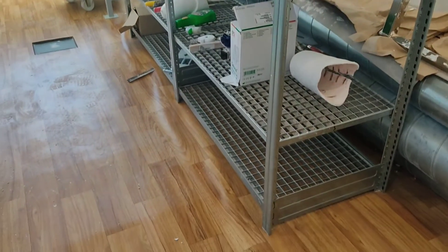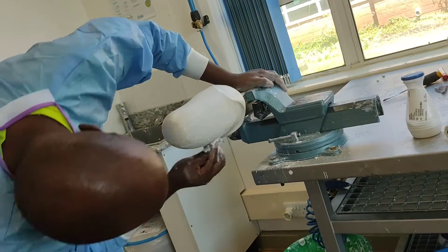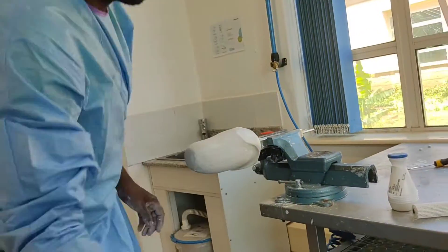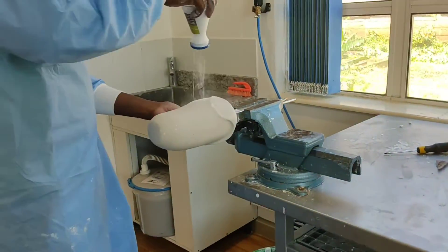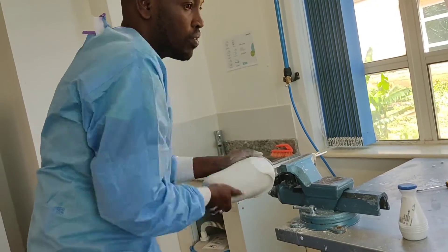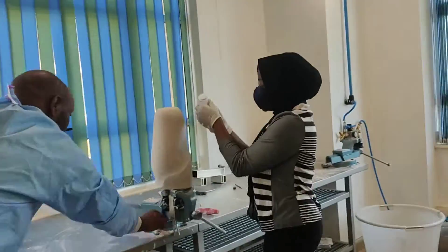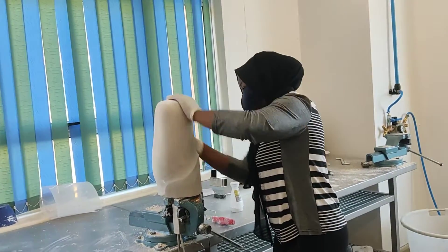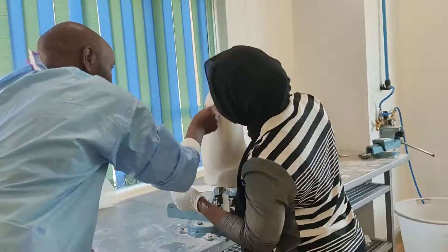Here is the casting room, and this is Moses smoothing and smoothing and smoothing. Here is the shiny end product of my permanent cast. Then Moses taught me one or two things about the smoothing of the cast, and here I am trying my hands on a prosthetic cast — it was so fun, thank you Moses!